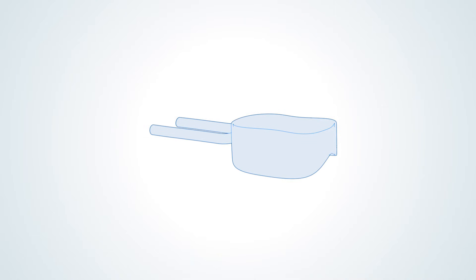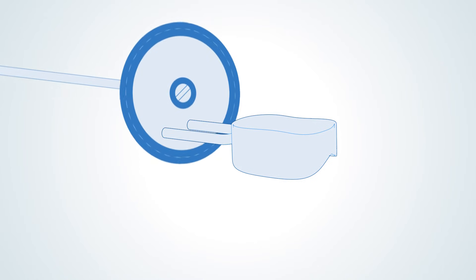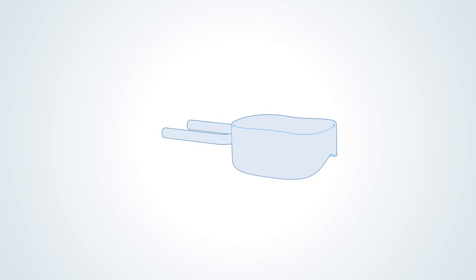In cases where the tubes are too long, they can also be trimmed using a diamond disc bur with a high-speed handpiece. Check the tube openings for debris and clear if necessary.